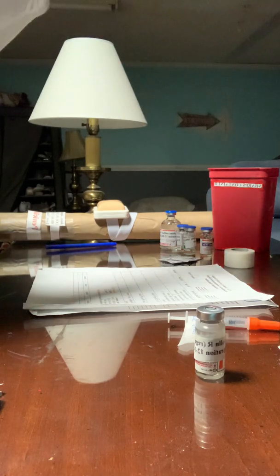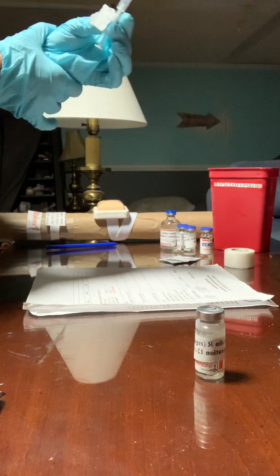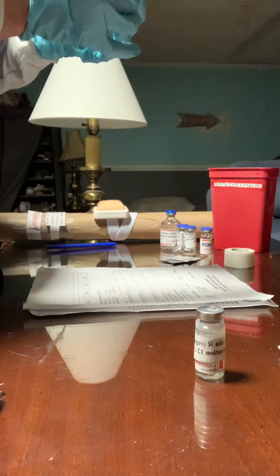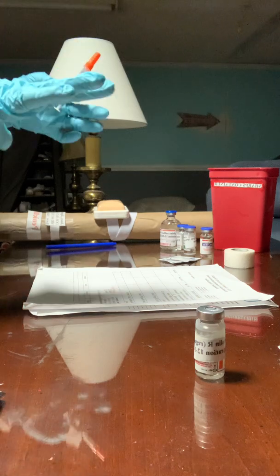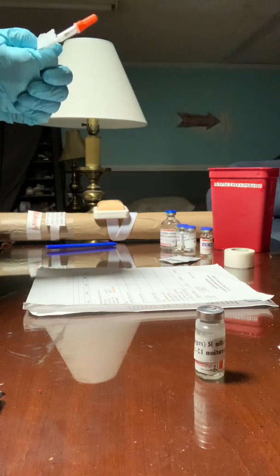Next, I will don my gloves. I will also be explaining to Mr. Jones what I will be doing. Mr. Jones, I am here to administer your insulin. It's 30 minutes before your meal, and I am going to administer your insulin so that your blood sugar would be maintained and be normal for you to have your meal. Pre-assessments look good.